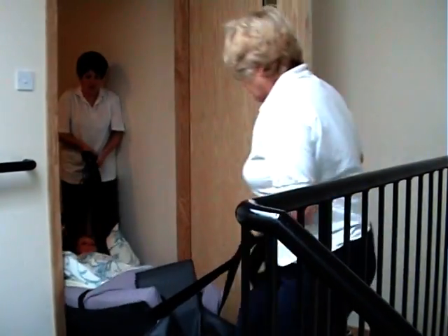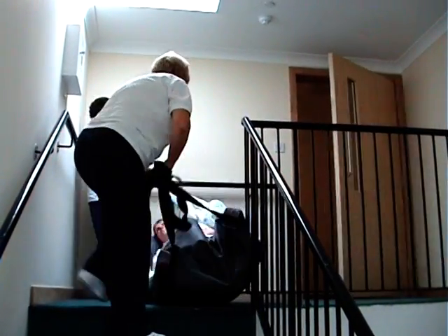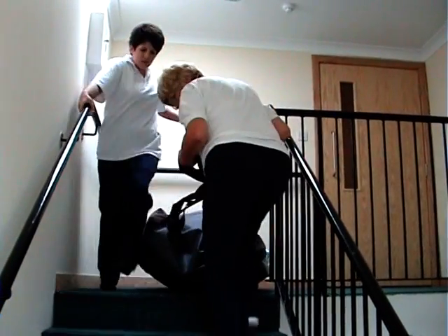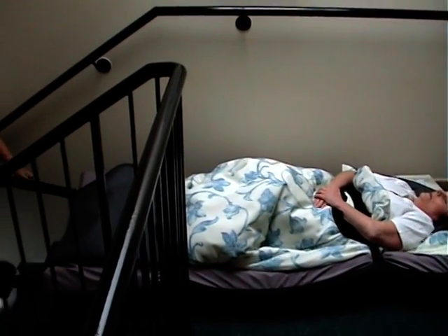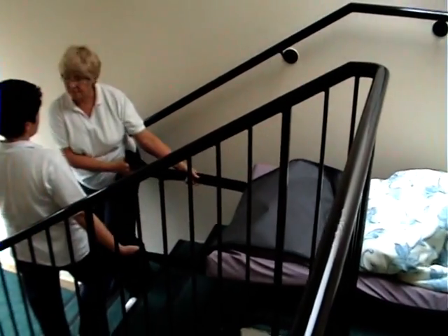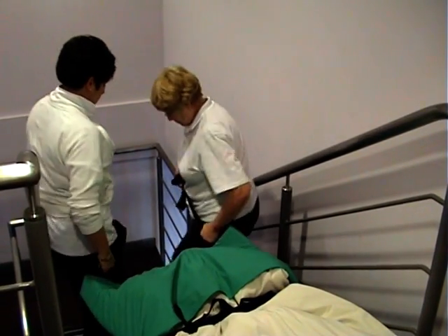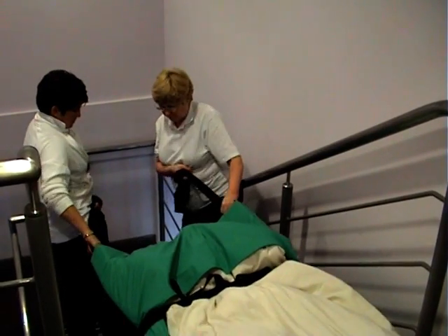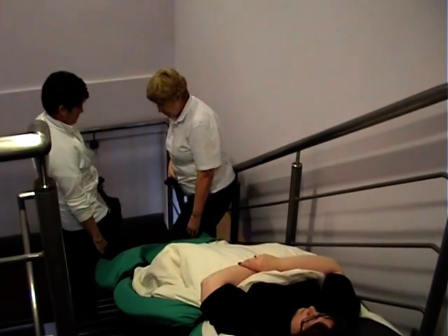To take the equipment down a staircase, bring the ProPad to the top of the stairs, walking down as far as you can go, keeping hold of the long straps. Lean forward and gently pull. When the legs are over the end of the stairs, gravity will then bring the ProPad down. To control the pad, lift the end up and it will slow. For a controlled descent, 2 people grasp the bottom handles, which should be crossed, lift the end of the ProPad and walk steadily downstairs.